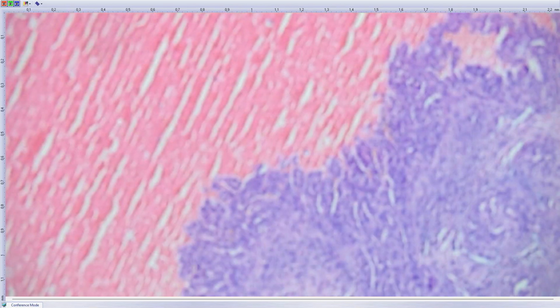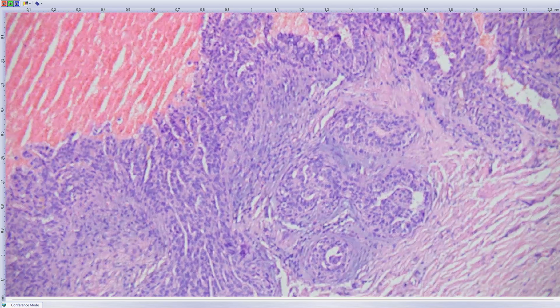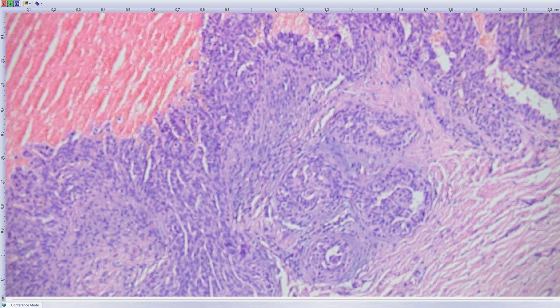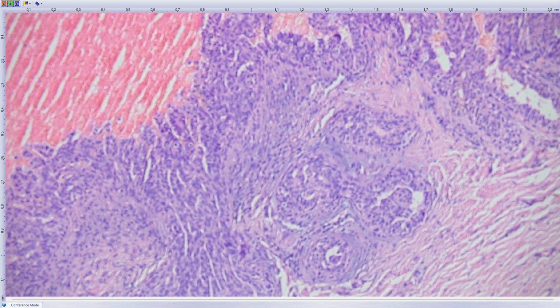And if you magnify these lesions, you find that the morphology is very similar to lesions of breast. Yeah, and when you find whatever that looks like breast pathology, it's always arising in so-called anogenital glands of vulva, and anogenital glands of vulva have perfect similarity to breast tissue, and they give rise to all tumors like in the breast.